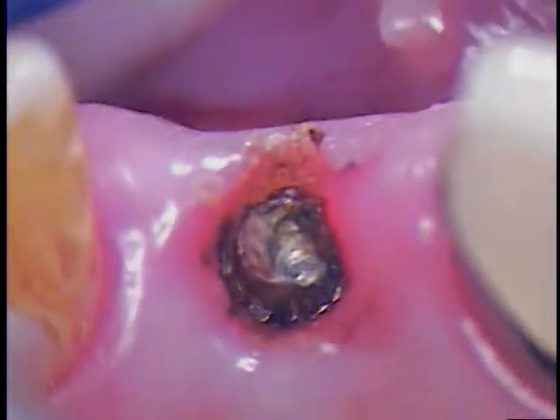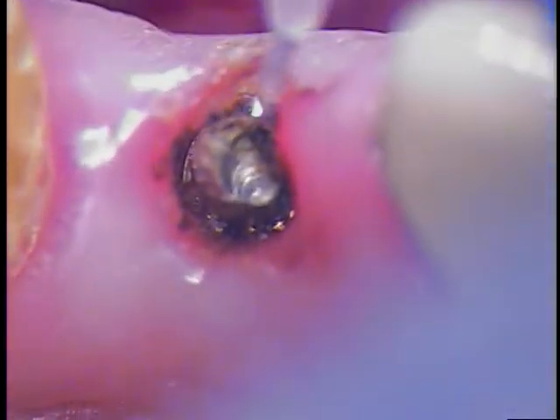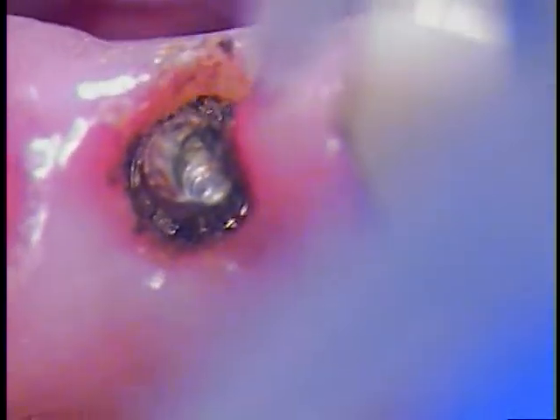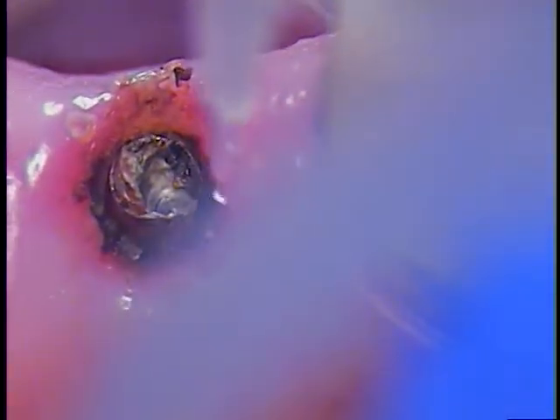In the middle. And careful not to go up any higher on the watts because I don't want to create necrosis. This is the insides of the papilla. Gently go up against it.